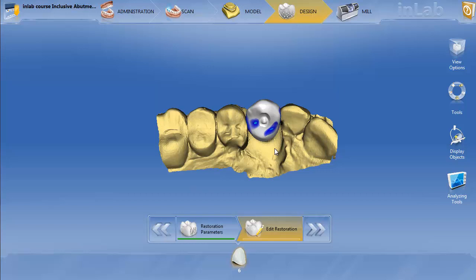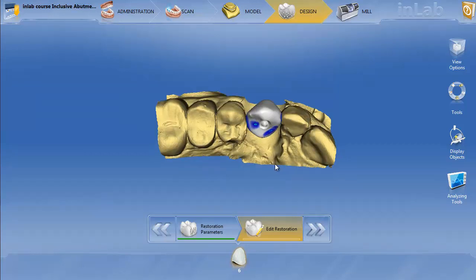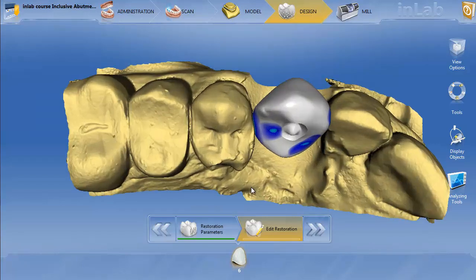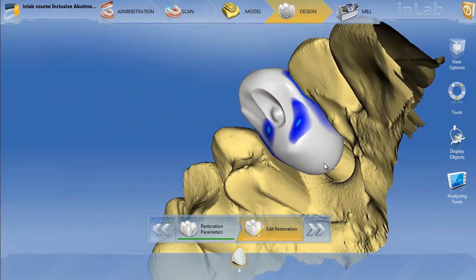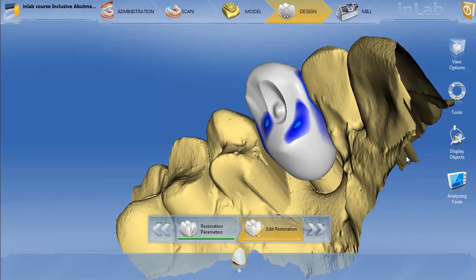In this video I'm going to show you how to make a custom Emax abutment on a 6mm Glidewell Tie Base. Now in this image you see here, this is actually what I originally did.